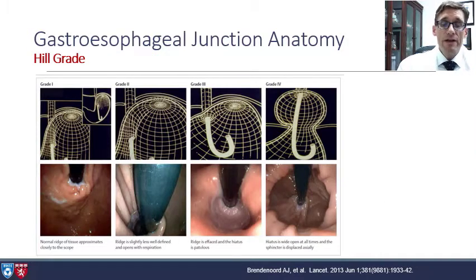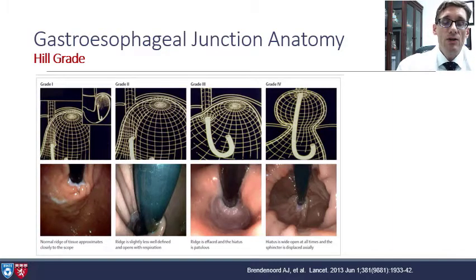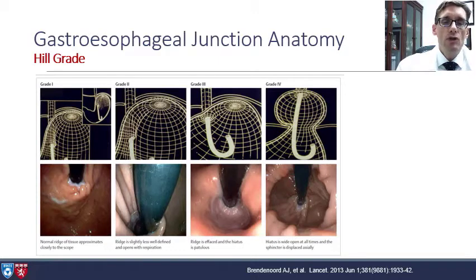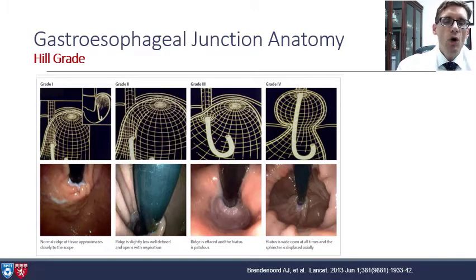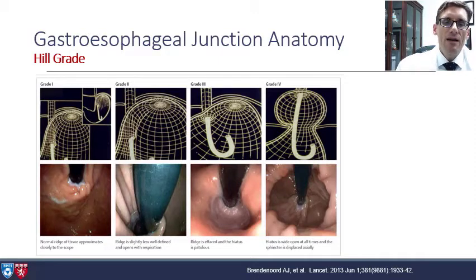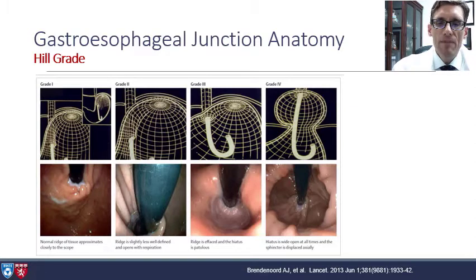Next, we have Hill grade, which is a very important part of the endoscopy examination while looking at the gastroesophageal junction. Hill grade 1 is normal — you have a nice intra-abdominal esophagus and a nice ridge. Hill grade 2, you still have a fairly well-defined ridge, however it starts to open up, especially with respirations. Hill grade 3, you have a complete effacement of that ridge. And Hill grade 4, of course, you have a hiatal hernia that is quite wide.